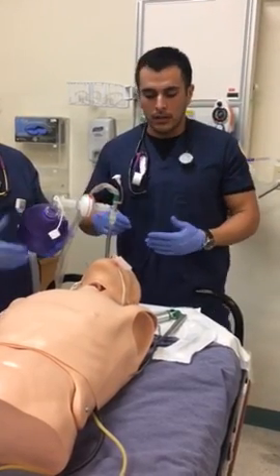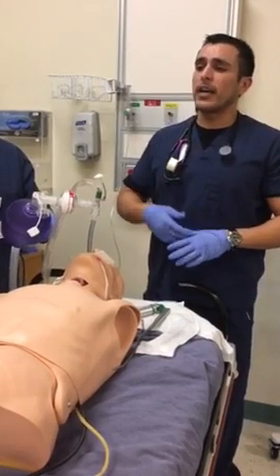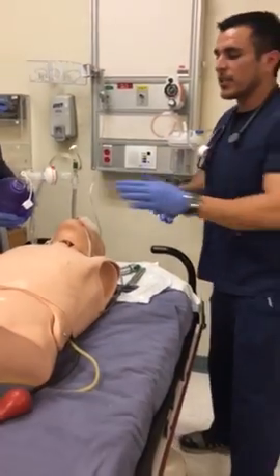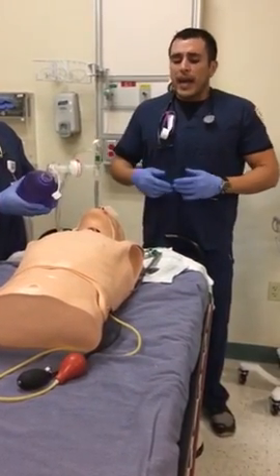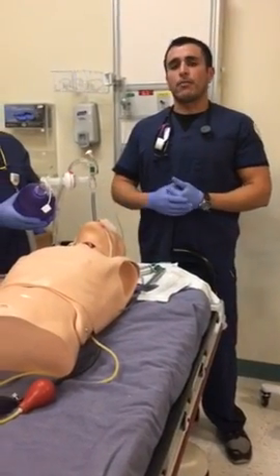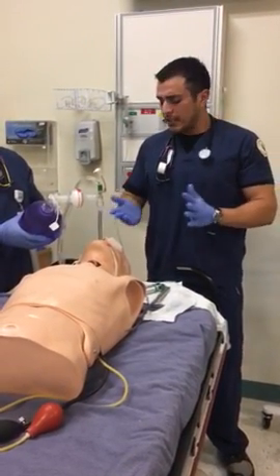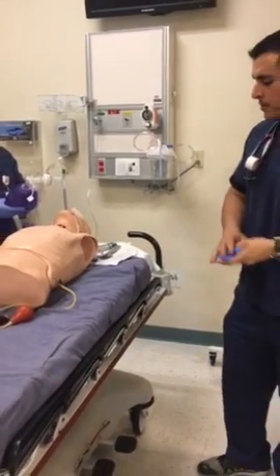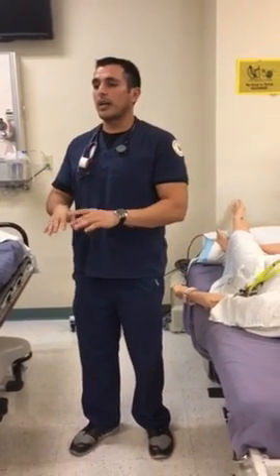After that, I would monitor things like his vitals, so heart rate, respiratory rate, blood pressure, saturations. I would listen again to lung sounds, make sure that I'm getting equal aeration. After that, I could bring in a whiteboard or a chalkboard, so that when the patient wakes up, they would have a form of communication. Once that's all done, I would take my gloves off, dispose of them in the trash, wash my hands, and I would go out and chart.